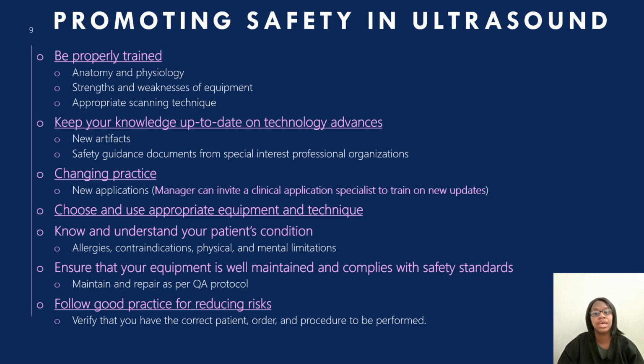Change in practice. Make sure that an application specialist comes in and trains new techs to use the machine so that they know how to use it and use it to their full ability. Sometimes you're training behind someone and they probably can't tell you all the ins and outs of the machine like an application specialist can. You want to choose and use appropriate equipment and technique.